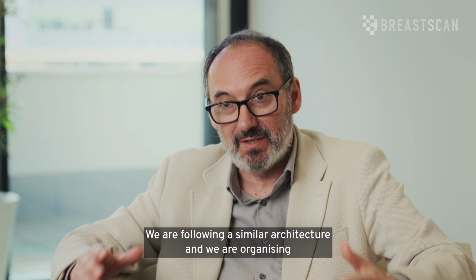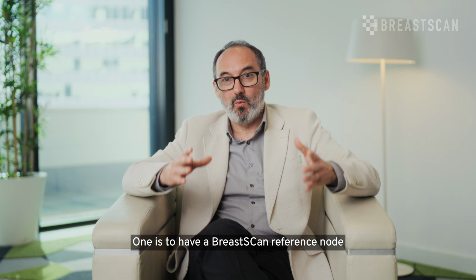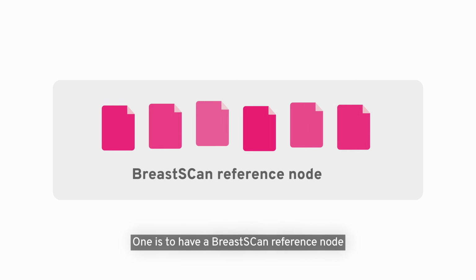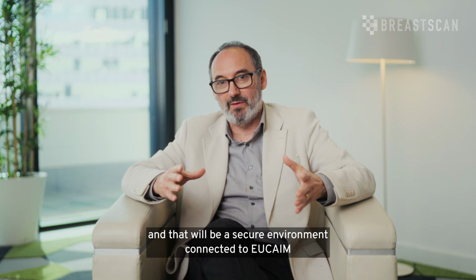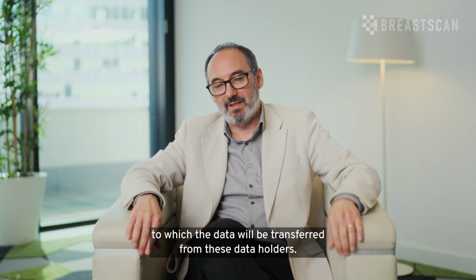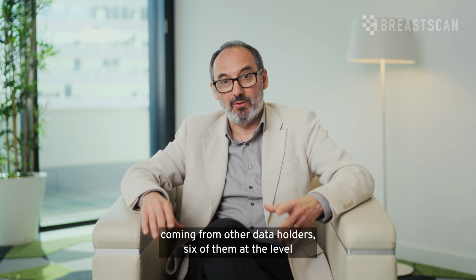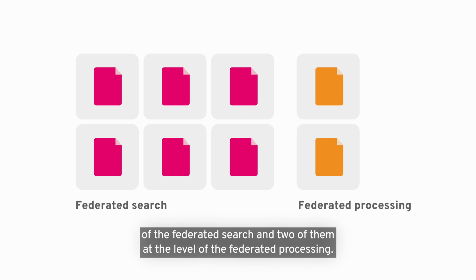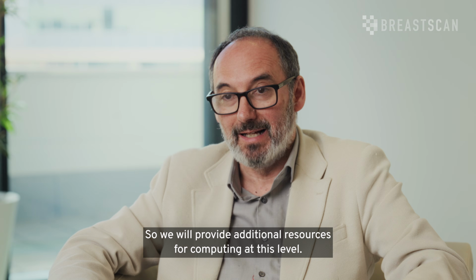We are following a similar architecture, and we are organizing the data holders in different ways. One is to have a BreastSCan reference node in which 6 of the providers will deposit their data, and that will be a secure environment connected to UCAME in which the data will be transferred from these data holders. We also have 8 additional federated nodes coming from other data holders, 6 of them at the level of the federated search and 2 of them at the level of the federated processing. So we will provide additional resources for computing at this level.